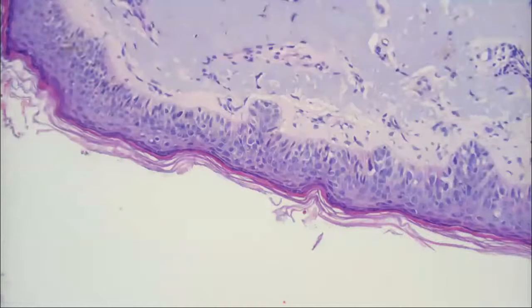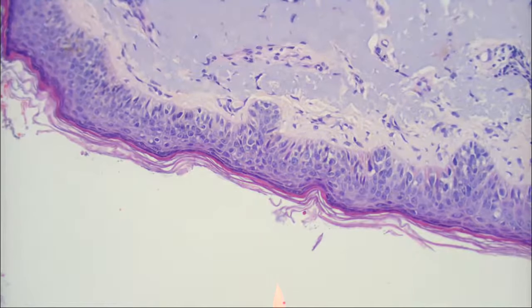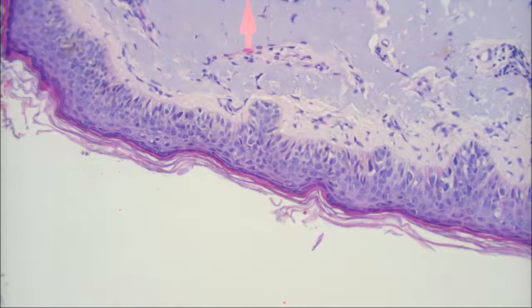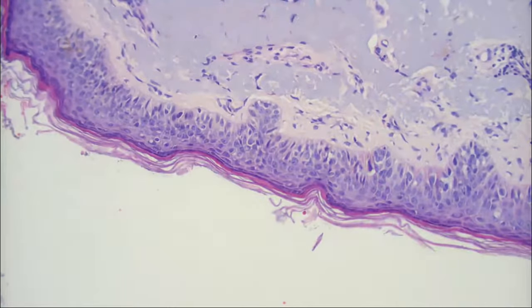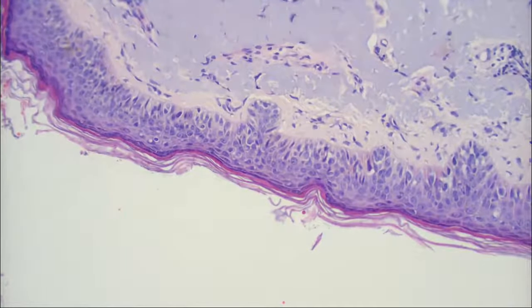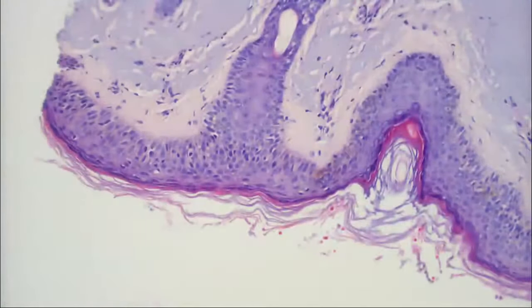That's a very good idea. And I think that's reasonable if you thought that. That's excellent. So what's in the differential diagnosis of that? So the actinic keratosis, Bowenoid actinic keratosis, or just Bowen's disease. Anything else? Bowenoid papulosis. Yeah, with all this sun damage, we wouldn't think so, would it? That looks more like a condyloma. But what else can look pagetoid or Bowenoid sometimes histologically, but it's not keratinocytic?